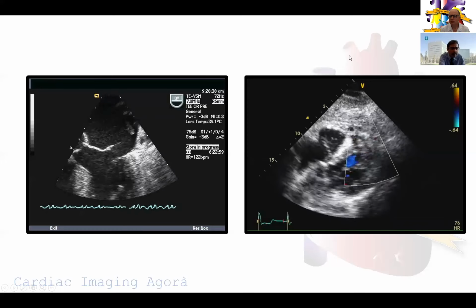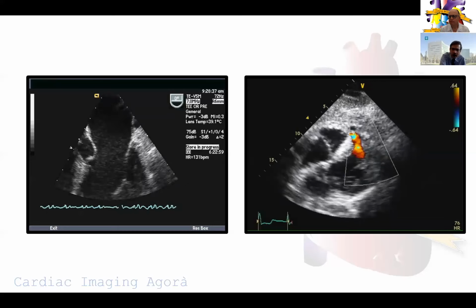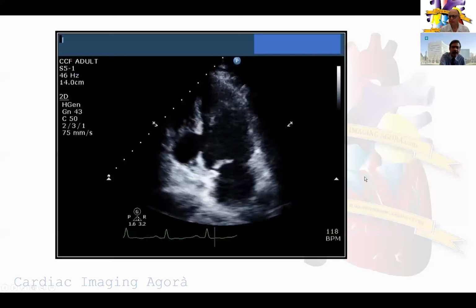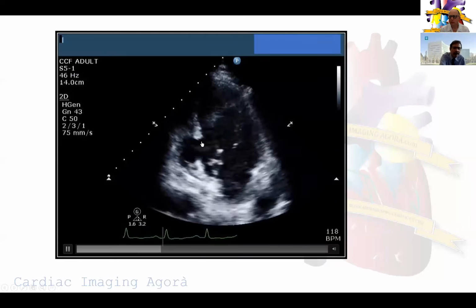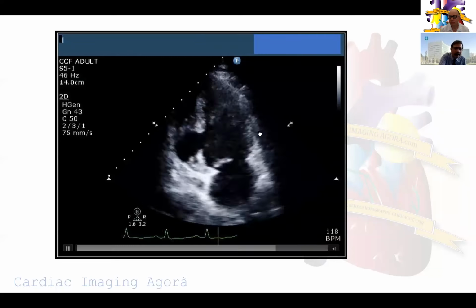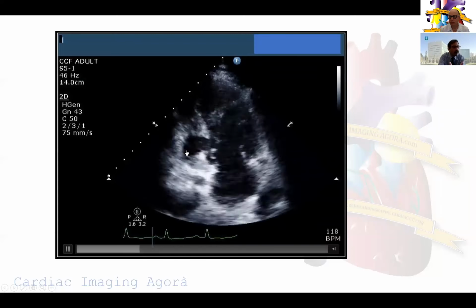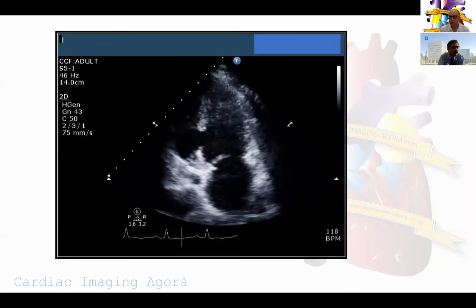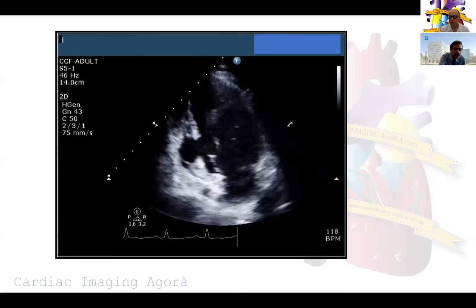Remember, I told you type 2 rupture is usually seen as an erosion of the posterior wall. So let me show you an example of a type 2 rupture. Here you can see a nice 2-chamber view of the echo, and you can see there's a complete, punched out lesion of the entire myocardium. Now this can sometimes be in the infero-posterior wall and can extend and be a pseudoaneurysm, and sometimes can present like a ventricular septal rupture in the inferior posterior aspect of the ventricular septum.